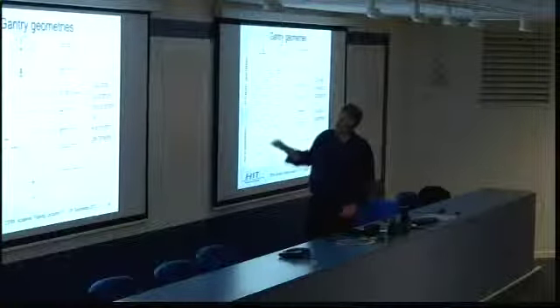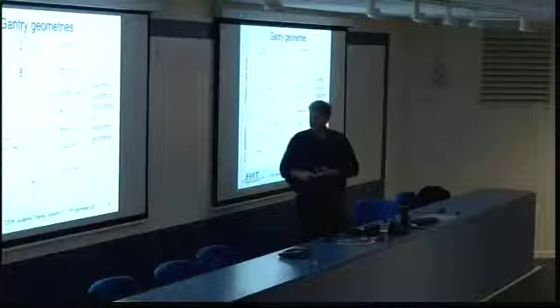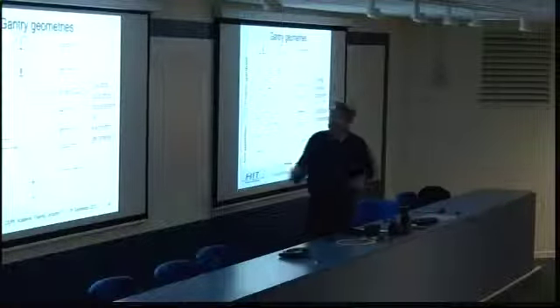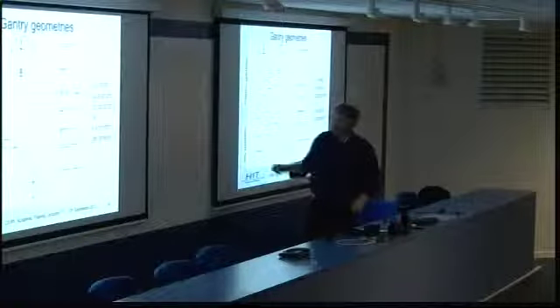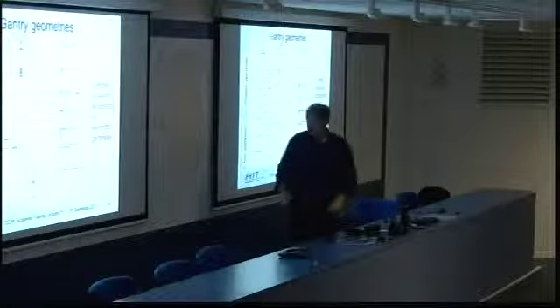The central question is always: do I have an isocentric gantry, where the patient is fixed and the gantry bends around, or do I choose an eccentric version of the geometry?